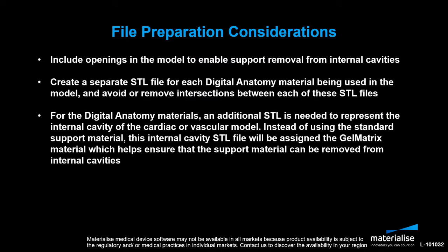To start, let's go over a few file preparation considerations for cardiac and vascular models. First, be sure to include openings in the model to enable support removal from internal cavities.